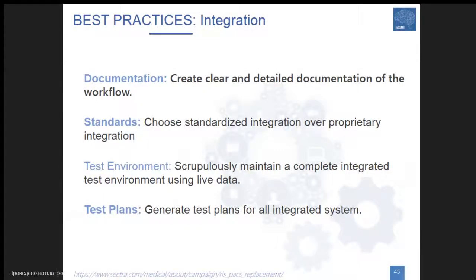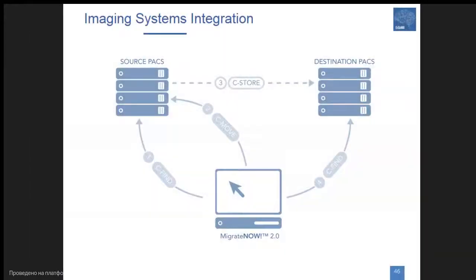What are the best practices? For example, for integration, you need to create a clear and detailed description of the workflow. You need to have clear standards, testing environment, and test plans for integrating the systems.